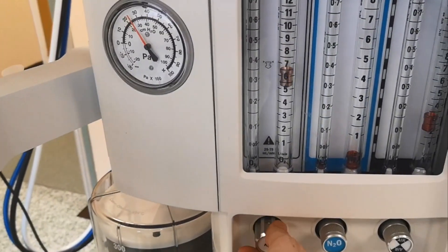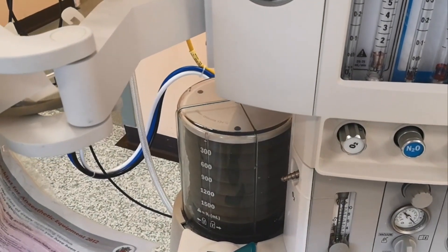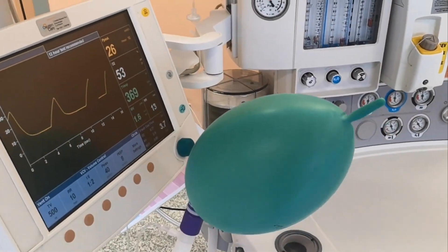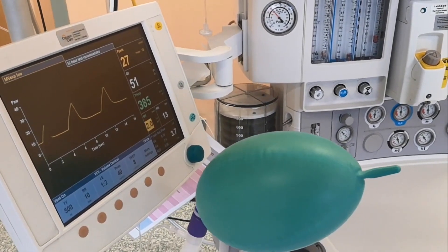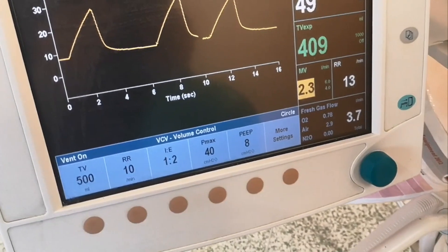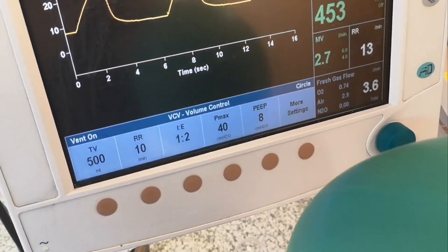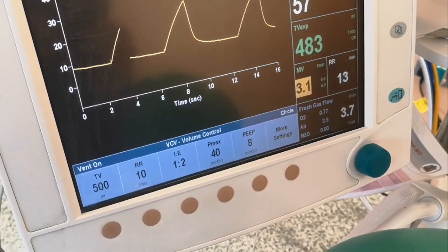Now the machine is working — it's delivering tidal volumes. I've attached a bag so you can see it delivering tidal volumes. That's the ventilation mode. You will be given instructions on the different settings required to ventilate patients in an ARDS-type picture.